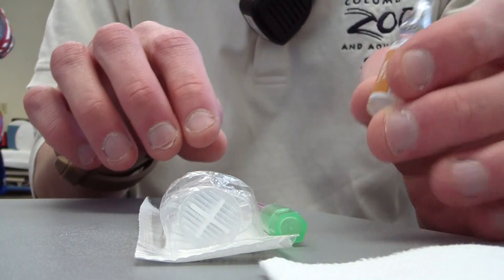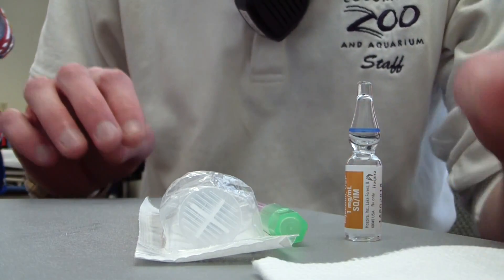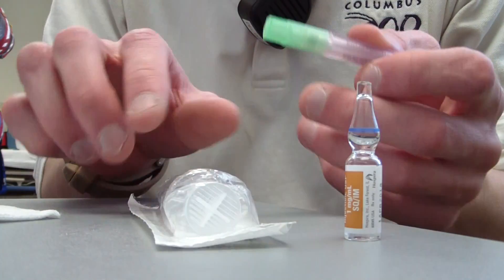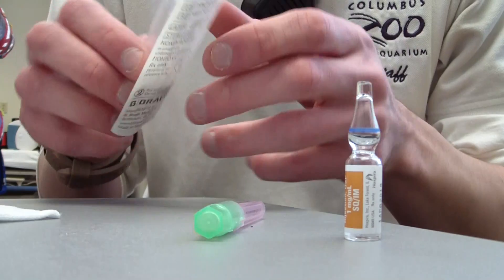You'll see it comes in a glass vial like this. Some of the things you're going to need are gloves, a piece of gauze pad, a filter needle, and a lure lock syringe.